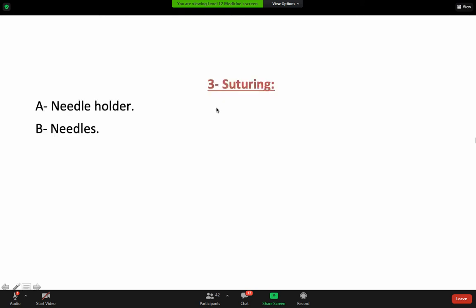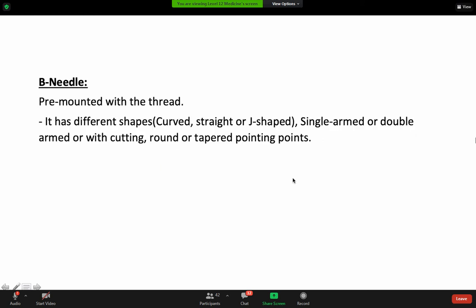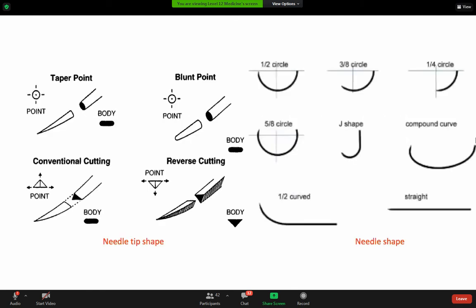Suturing materials include needle holders and needles. Needle holders can be fine or thick, long or short. Some, like the Castroviejo, are used for small needles in vascular or plastic surgery — sizes 5-0, 6-0, 7-0 and smaller. There are also larger needle holders for bigger sutures. The needles are pre-mounted with a thread and come in different shapes: curved, straight, and J-shape.